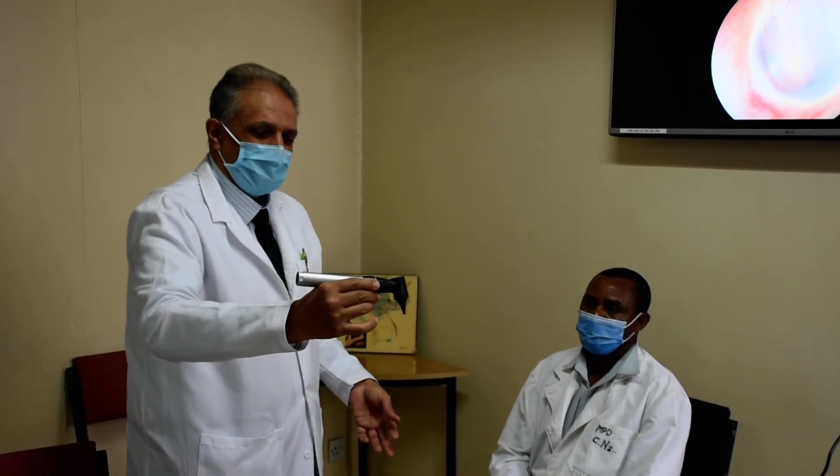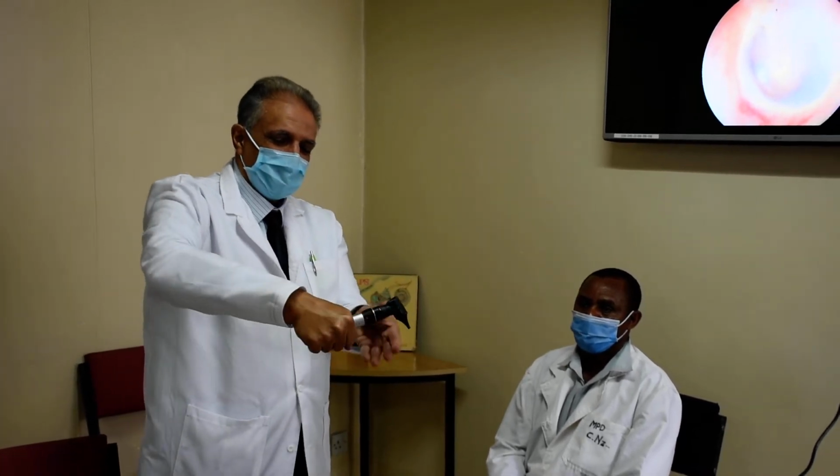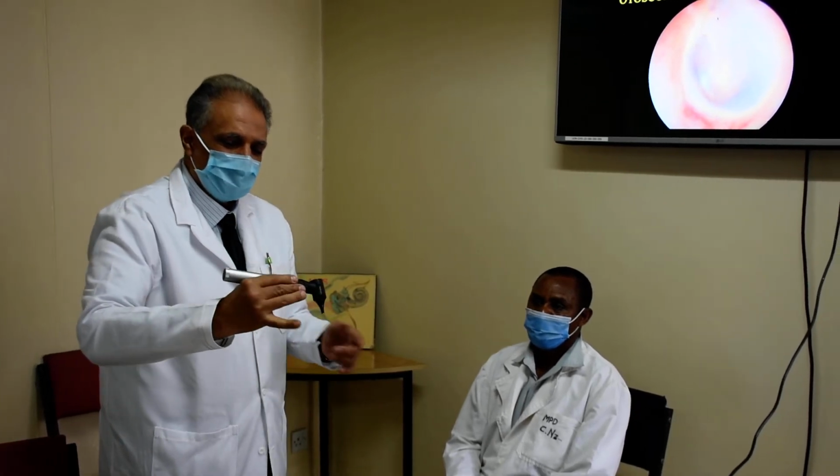So, you clean it and you hold it like a pen, like that. You don't hold it like that or like that. You hold it like a pen. And this little finger of yours, you'll see it has a very important duty, which I will demonstrate to you.